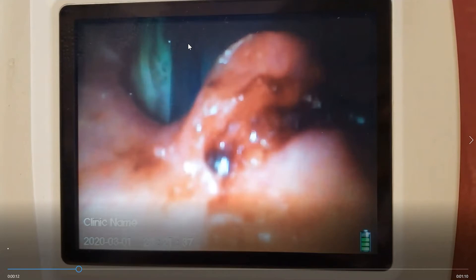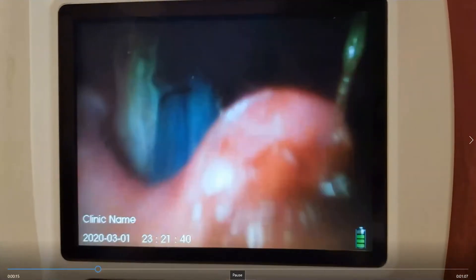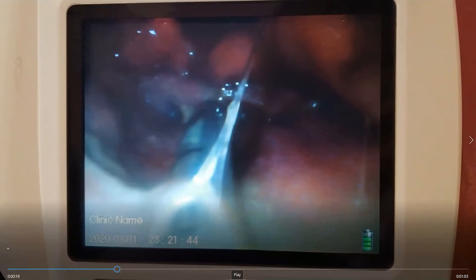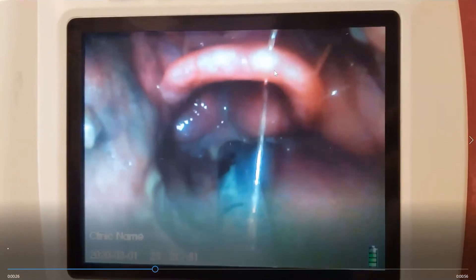The nasogastric tube is really helpful because it shows you where the esophagus is — obviously where we don't want to be. We want to be in the glottic opening. Continuing down the base of the tongue, the arytenoids come into view, and here is the esophagus with the nasogastric tube entering it. We also see heavy secretions — this patient was intubated because of aspiration. I withdraw slightly and re-advance to get a nice view of the epiglottis, the vallecula behind it, and the arytenoids.